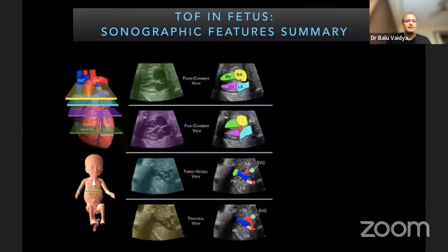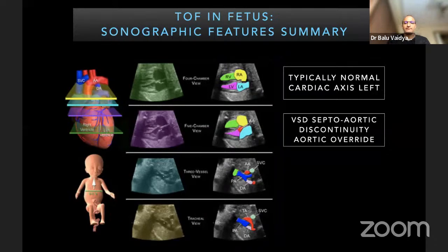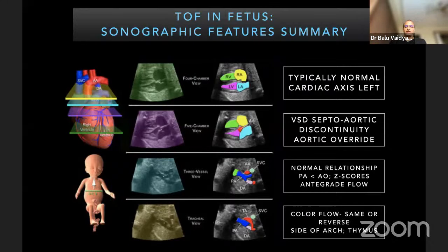The findings of tetralogy of Fallot: four chamber view — typically normal structures, axis could be shifted to the left. Five chamber or LVOT view — septo-aortic discontinuity. Three vessel view — normal relationships of great arteries, pulmonary artery smaller than the aorta. Three vessel tracheal view — color flow and the side of the arch. As a bonus, the thymus can be seen, which gives clues towards your probability of associated 22q deletion. This is the sonographic summary of the features of tetralogy of Fallot.